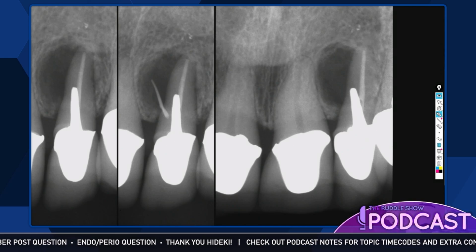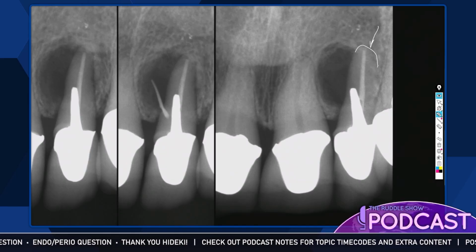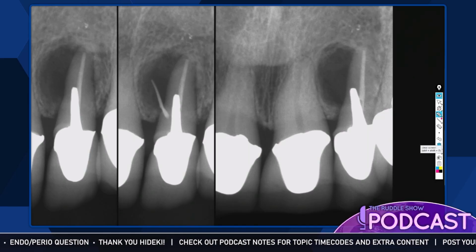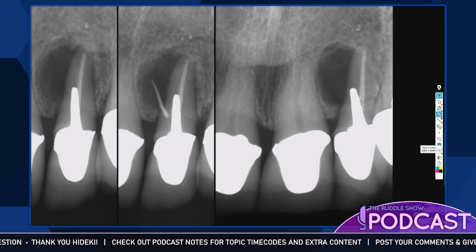Now, I want to talk about retreating this gutta percha because you're thinking, there's not so much pathology. The bone's quite good around. I might even see a PDL. So there's the world that is, and there's the world you see, and they're very different. You'll see that. Remember this gutta percha, and we'll show it in a photograph.